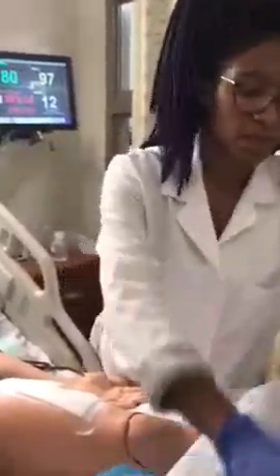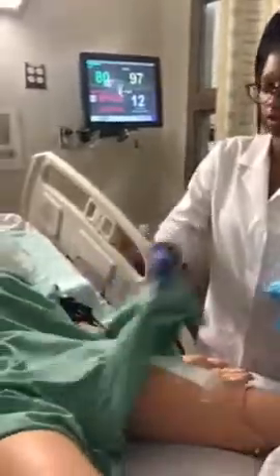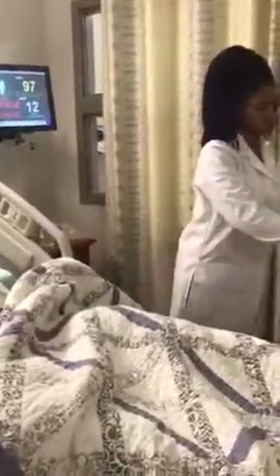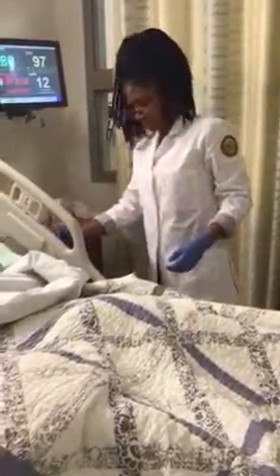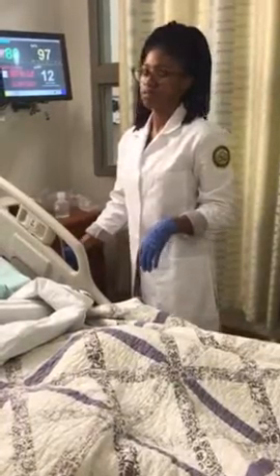Now, clean up. Ask my patient if they're in any pain. Patient reports that they're not in any pain. Return them to a comfortable position. And make sure to put the bed back all the way down so my patient is safe, and that completes my sterile wound dressing.